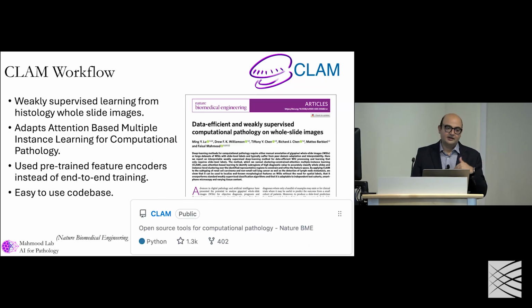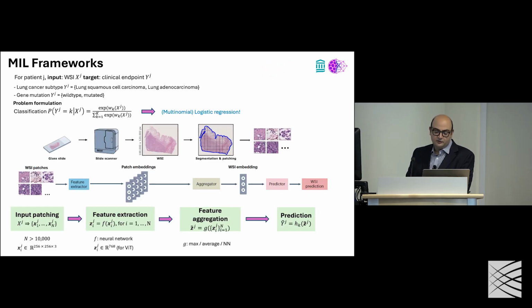And we made this tool publicly available, and over time this has become very widely used and has been applied to almost every disease model that's tackled using computational pathology. So the basic workflow is actually very simple. You have whole slide images. You scan them. Once they're scanned, you have a large hierarchical image. You can segment the tissue, patch it into smaller patches, and then you can extract features, right?